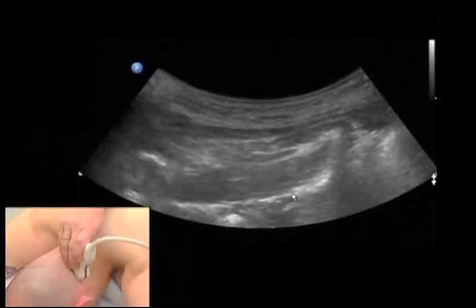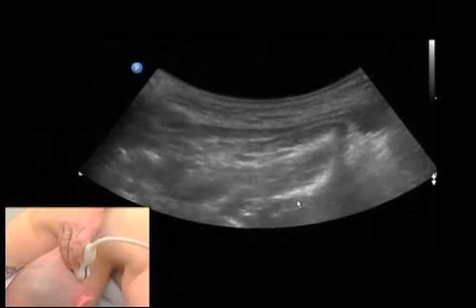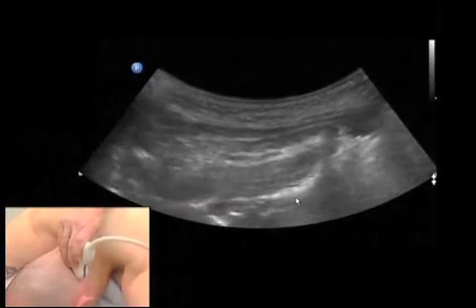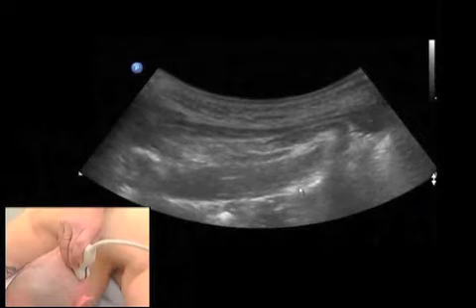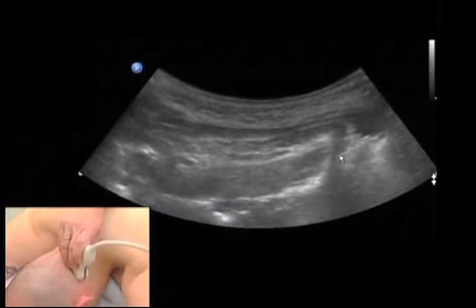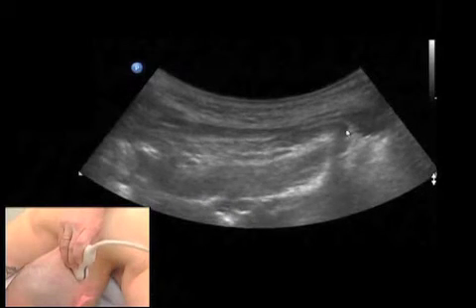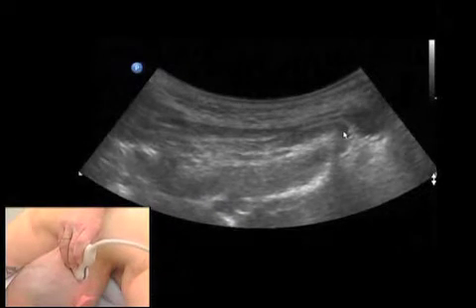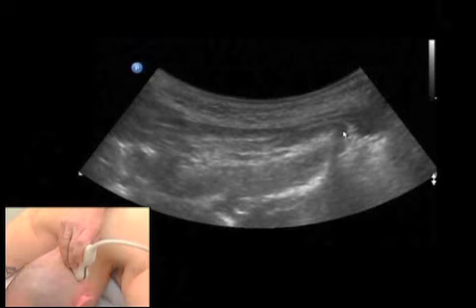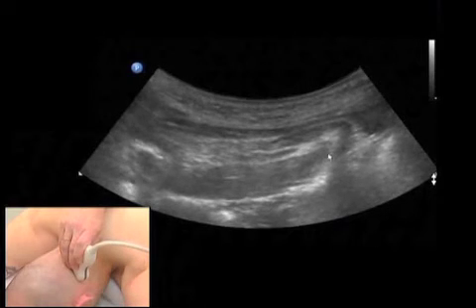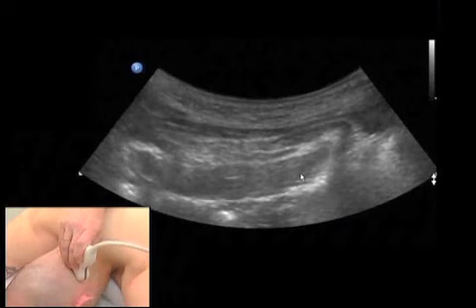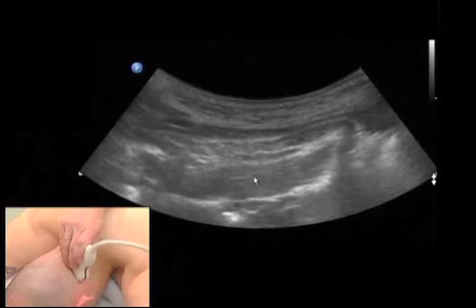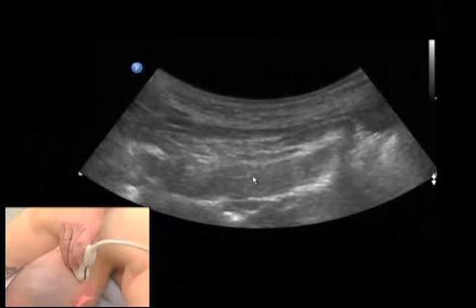You can also use a curvilinear probe. This has the advantage of a very, very good overview. And in the ultrasound picture, you see the typical spinous process of axis. And then you see your key muscle, which is the obliquus capitis inferior muscle.